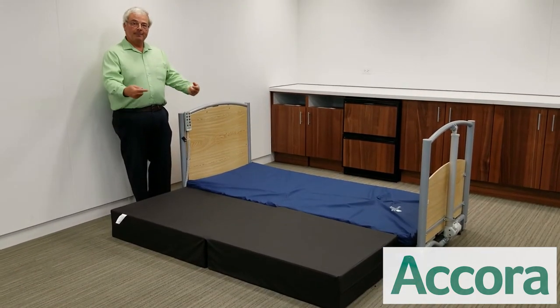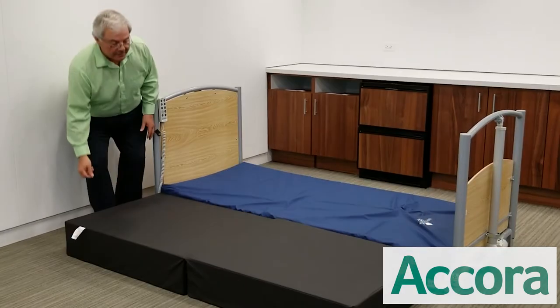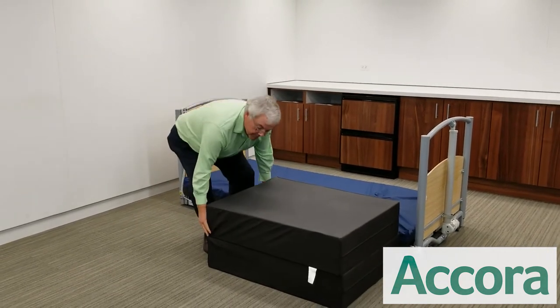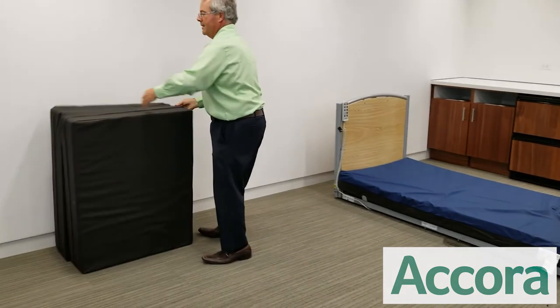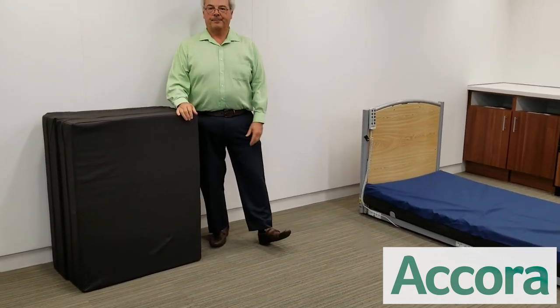The safety mat has a non-skid bottom, which helps prevent it from moving. It's also easily removed simply by flipping it up, picking it up, and moving it out of the way when the bed is not in its floor bed position and the patient is attended.